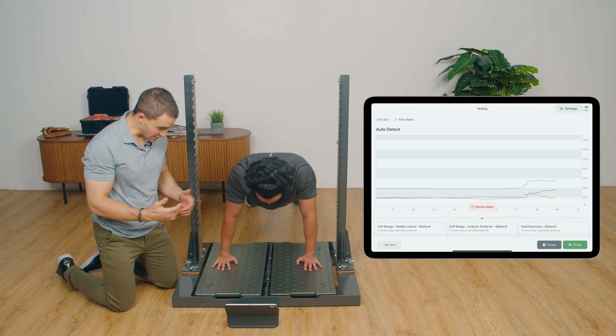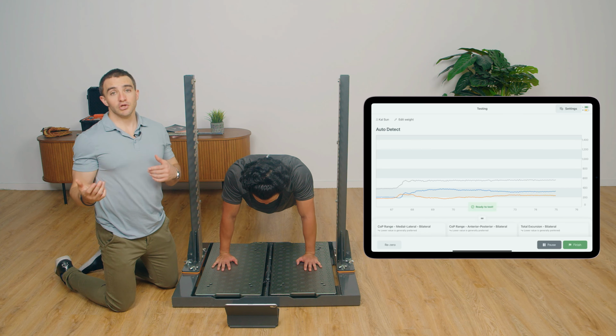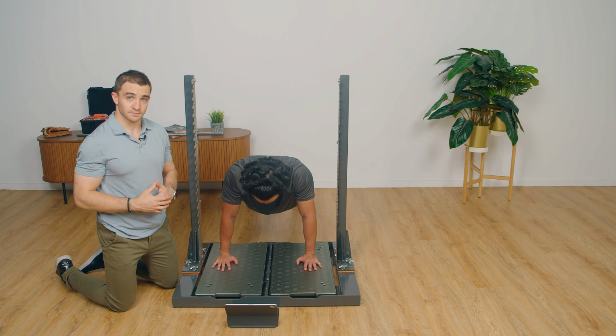Good. Same thing there, go ahead and shift side to side. I might say, Cal, I want you to shift as far as you can onto the right, hold for 5 seconds, back onto the left. You can determine, based on the patient you're working with and what your rehab goals are, how you want to progress in an exercise like this.